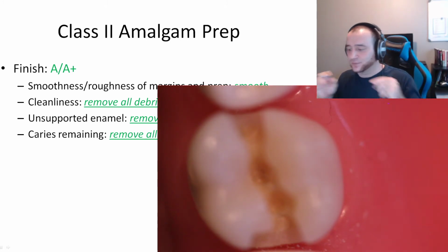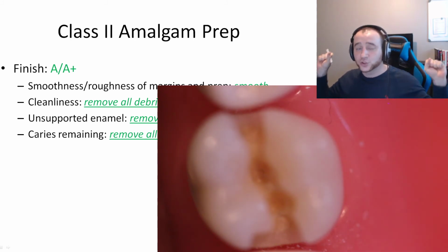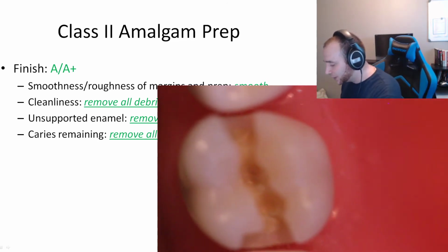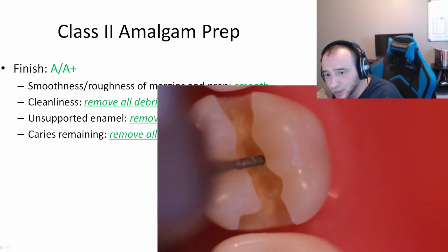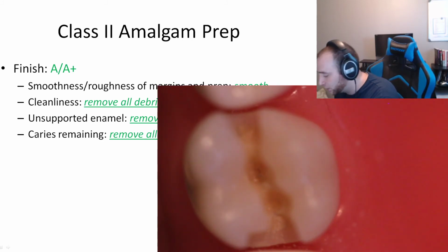So what happens is, first of all, it's high speed. The high speed is going to cut that really quickly. The water is going to rinse it and it's not going to leave any marks because there's no friction to leave those marks. And that way I was able to get rid of it. Even in the exam, this happened with me, and I was able to get rid of it with high speed, just touching that dark spot there with the high speed and a lot of water.